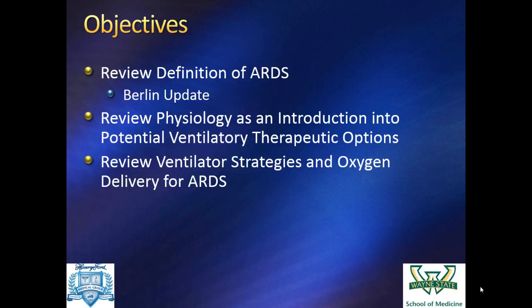And it goes to the idea, for me, about the compliance of the lung being different, and you don't know how much of those airway pressures are actually being transmitted. But it was interesting reading the editorial to the ARDS study where Roy Brower said, well, we're working so hard to recruit this lung, maybe we should just leave that lung alone. If it's not easily recruitable, we shouldn't try to recruit it.